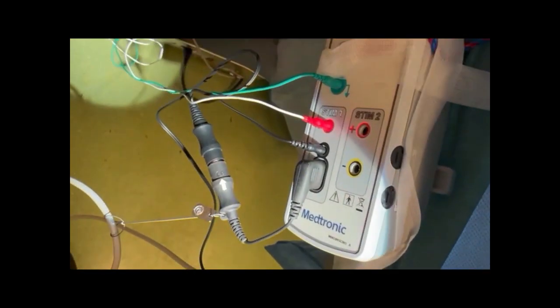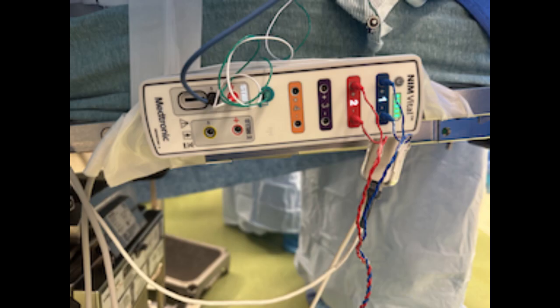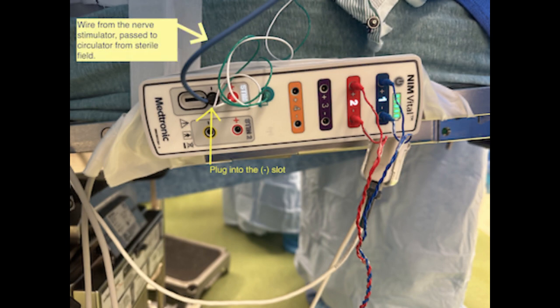The other end plugs into the patient module with two different plugs. A different and simpler type of nerve stimulator has just one plug — shown here in blue — and it's plugged into the black circle plug-in.